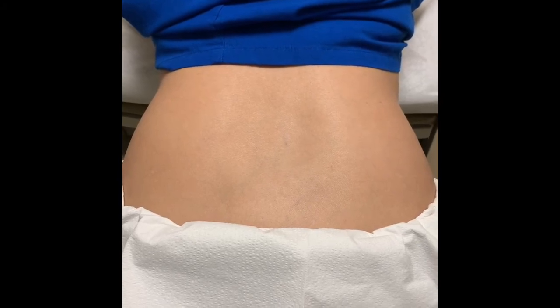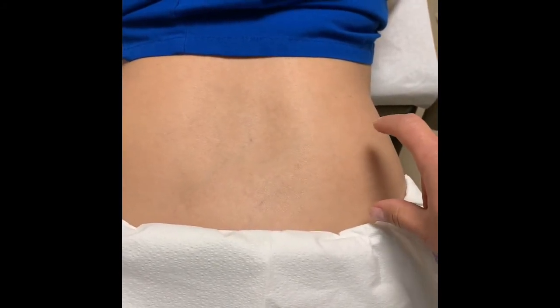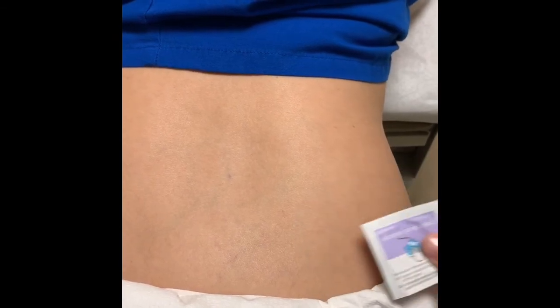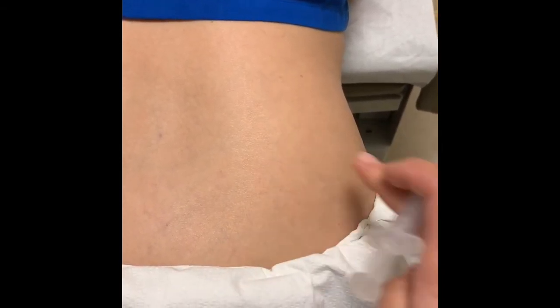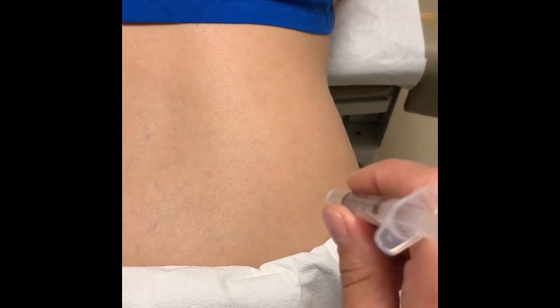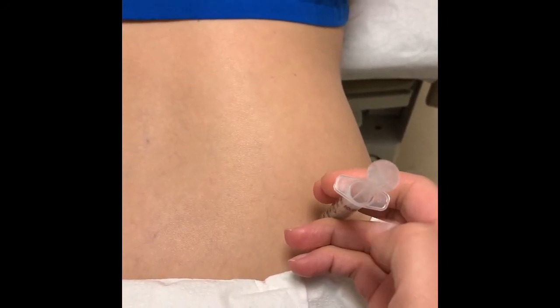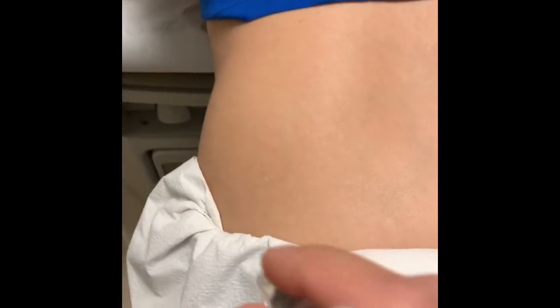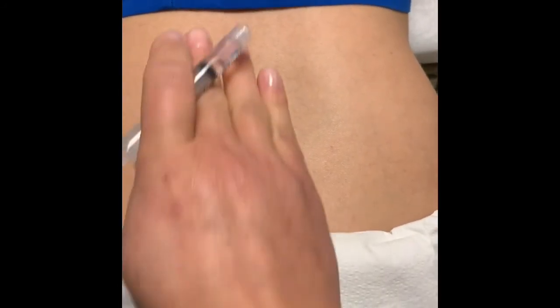If your partner is giving you this injection, you can lean over a chair or table, or lay flat on a bed. Again, you're going into the upper outer corner — nowhere near the spine, nowhere near the cheeks. If starting on the right side, take the pressure off that leg by leaving just your toes on the floor. Wipe the spot with alcohol, and once it's dried, in a quick darting motion go straight in. Flick back on the syringe a little — as long as there's no bright red blood, push down slowly.